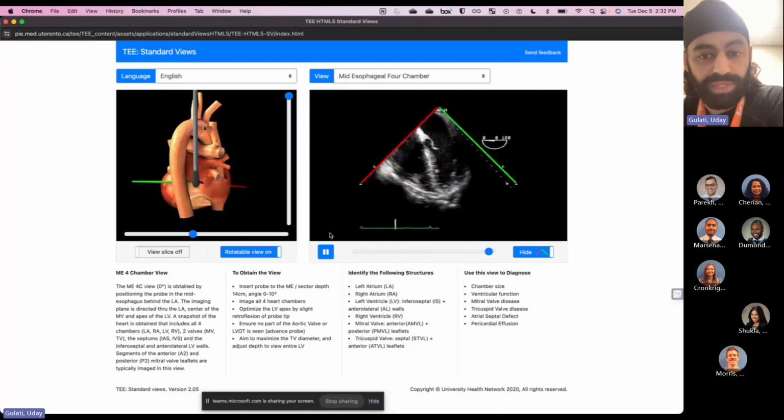And so now, do you guys see how to manipulate yourselves to get this image? The way I think about it is if I'm standing behind the patient, I'm looking at it forward. I'm basically seeing that if I am standing at the top of the screen and I'm looking straight in front of me, that's what I'm seeing. And that's how I like to think about it.